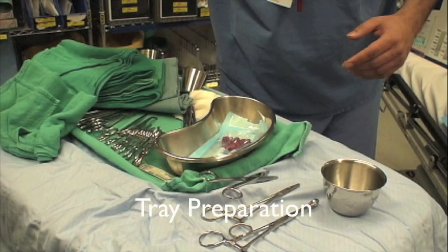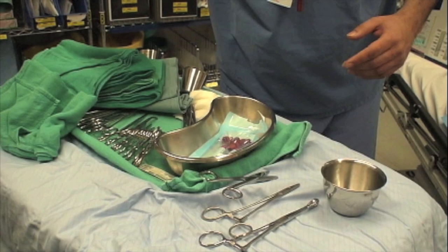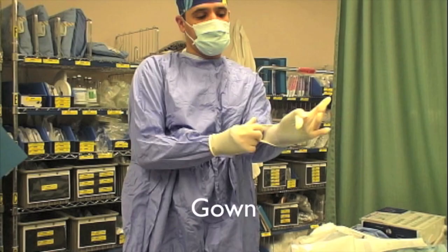Open the tray. Set aside sponge forceps, needle driver, and scissors. Prepare local anesthetic, povidone solution, scalpel, flexi-track, and suture. Don mask, gown, and gloves.